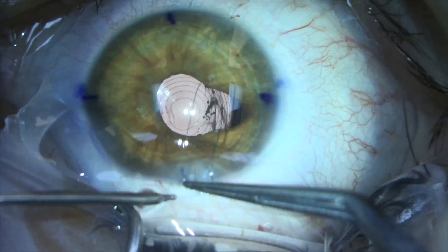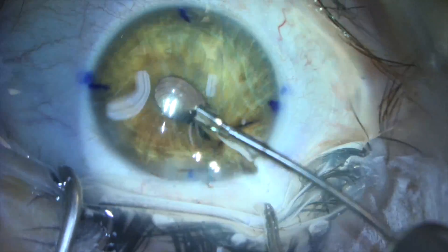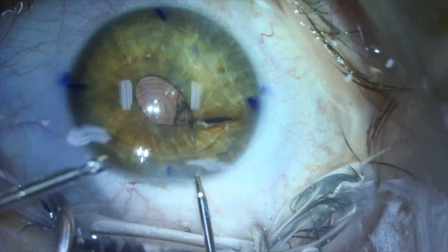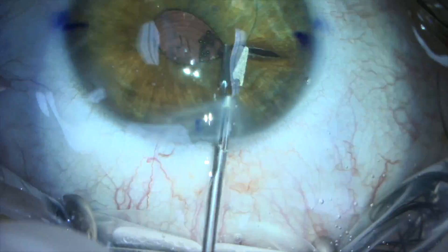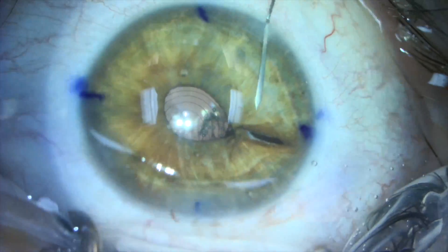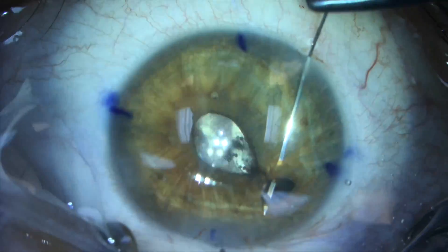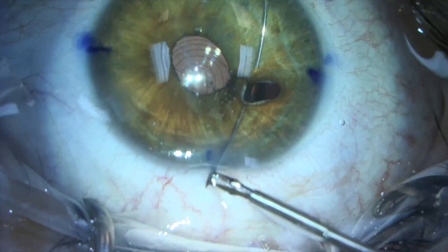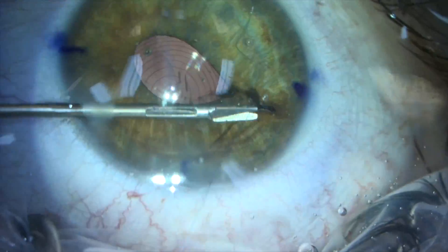The suture is then exteriorized and tied using a Sipser sliding slipknot technique with a 3-1-1 tie. The ends of the suture are then trimmed. A small defect in the iris remains between the newly formed pupil and the iris root. One additional suture is placed to close this defect, again tied using the Sipser sliding slipknot.